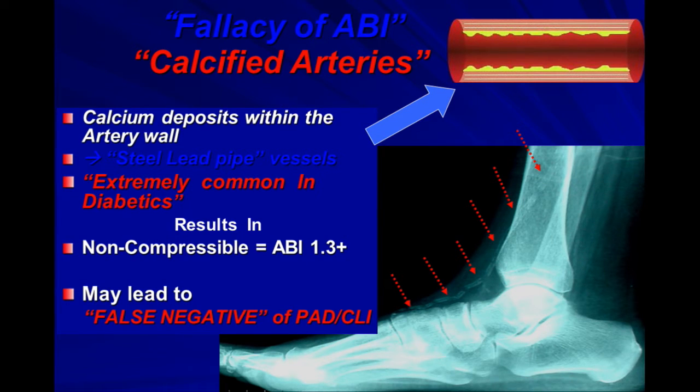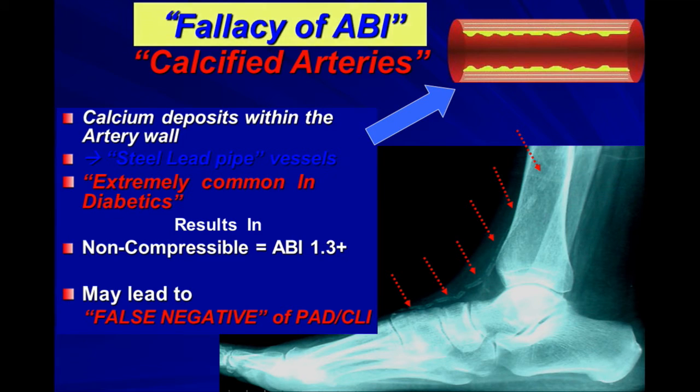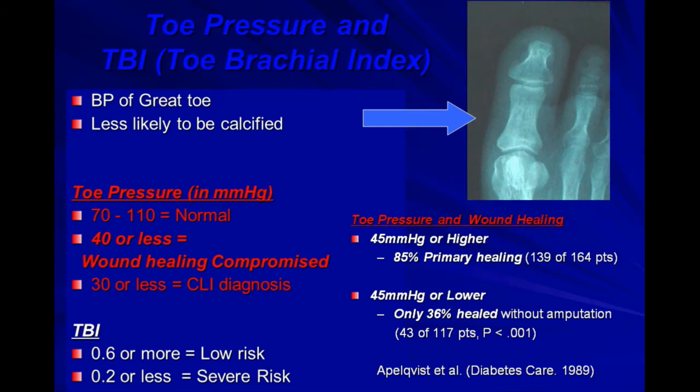So here's the problem with diabetics: medial calcinosis, so that calcium deposits within the arterial wall, and this leads to almost like lead pipes. So it's very common. We actually, when we reviewed our non-invasive tests at the Deaconess many years ago, we had to throw them out because over a third of the patients had falsely high pressures. And really, when you get that arm cuff up greater than 230 millimeters of mercury, it becomes a little bit too painful. So again, falsely high pressures; a low ABI is significant that something is going on. So again, it has to be done with a word of caution in diabetics.